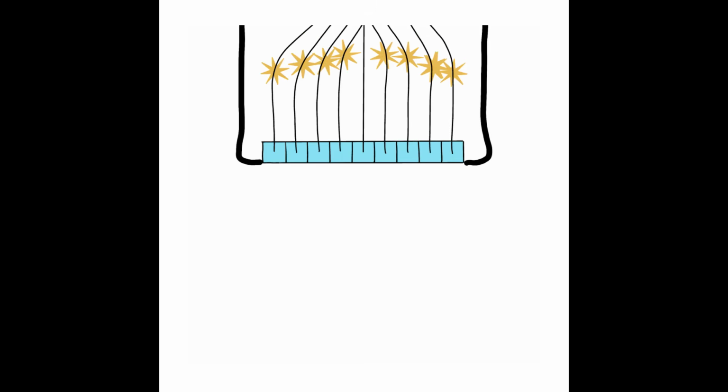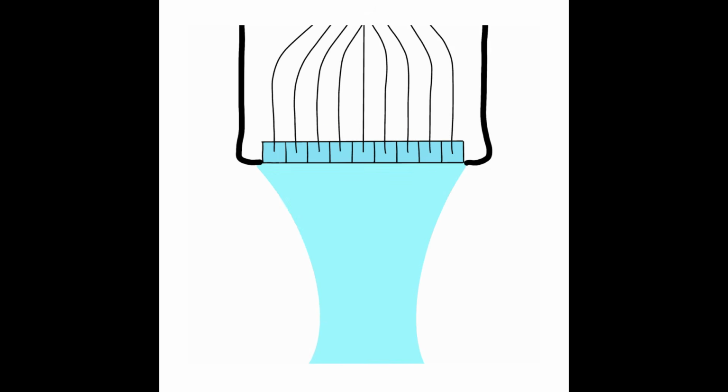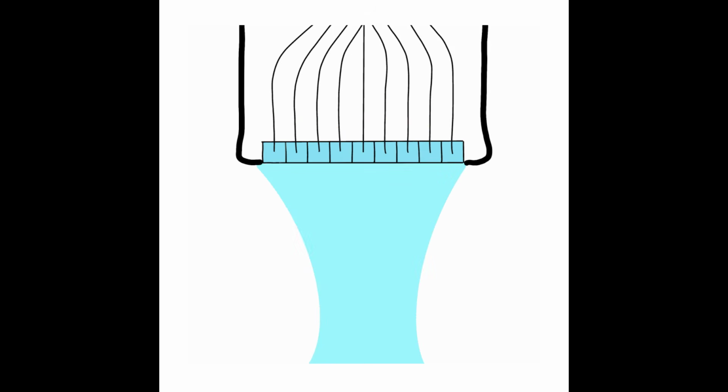The foci are created by interference, both constructive and destructive, from the little wavelets. Remember those V-shaped wavelets that are coming out of the elements. They're going to work together to create a focused beam, and the machine can dictate where that focus is based on the curved pattern it presents.